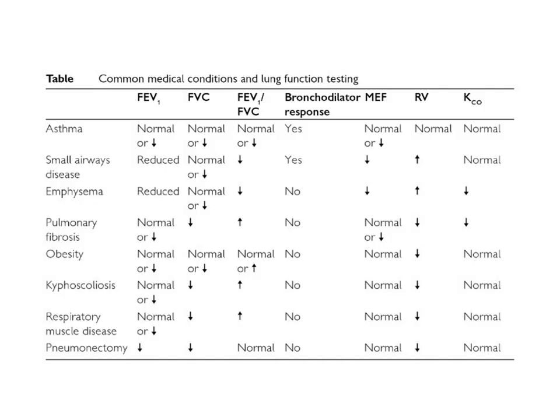In conclusion, this slide shows you how we apply in medicine the parameters of the pulmonary function test. You can see here many parameters like the FEV1, the forced expiratory volume in the first second, the FVC, the forced vital capacity, and the ratio between them, that's to say the forced expiratory volume in the first second divided by the forced vital capacity.